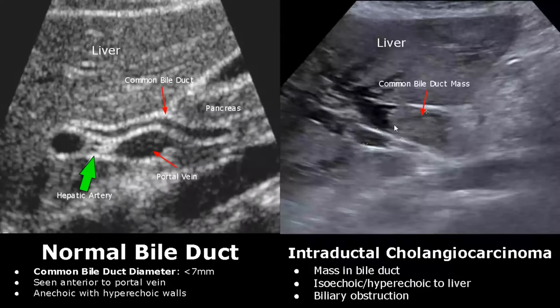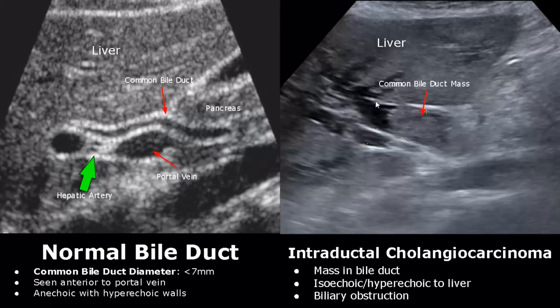Cholangiocarcinoma refers to bile duct cancer. The first type is intraductal cholangiocarcinoma, in which a mass is seen in the bile duct. It can be either isoechoic or hyperechoic to the liver, and the bile duct is obstructed as well.